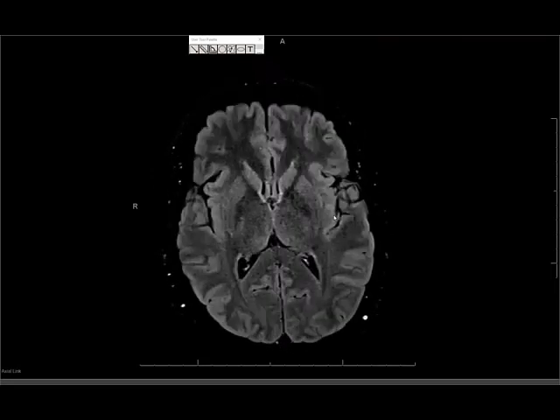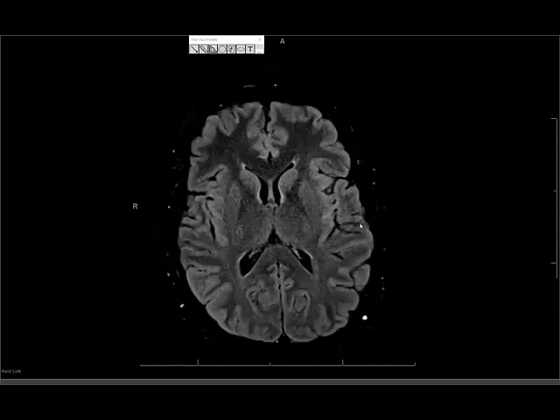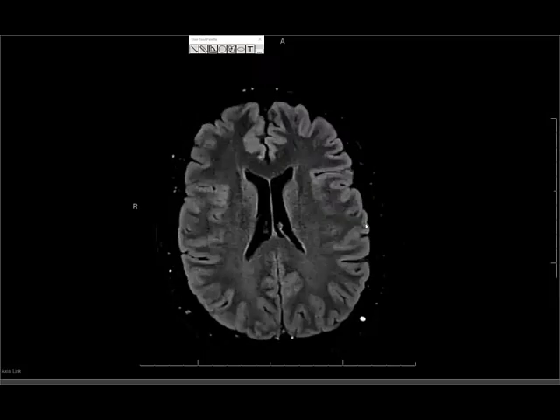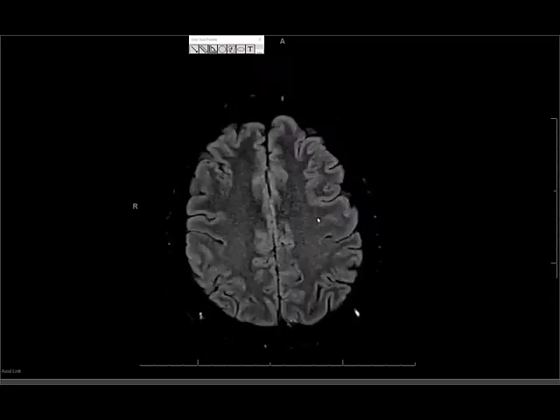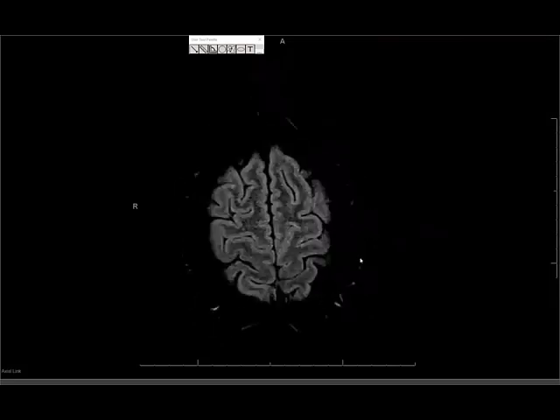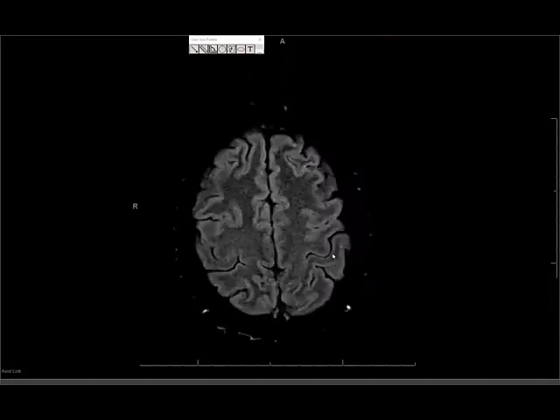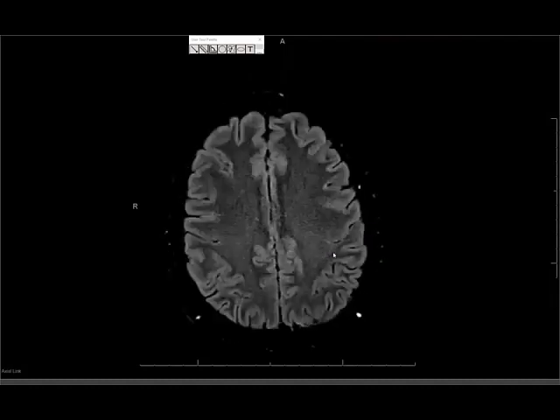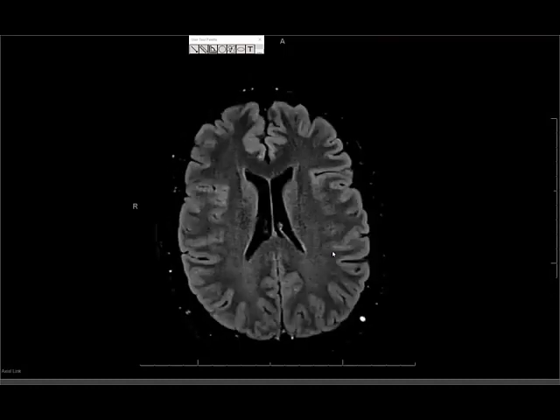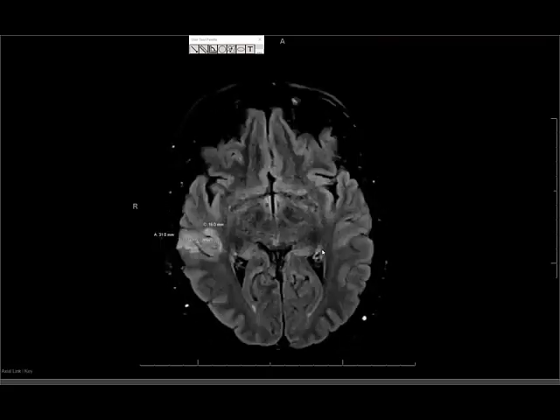All you're trying to do at your stage is figure out if something looks abnormal. You don't have to focus too much, especially for first years, on what that abnormality is. If you can differentiate between abnormal and normal, that's good enough. I like to scroll through at least two times, slowly. You'll see that there is something clearly wrong — there is an area of signal abnormality marked on this image.